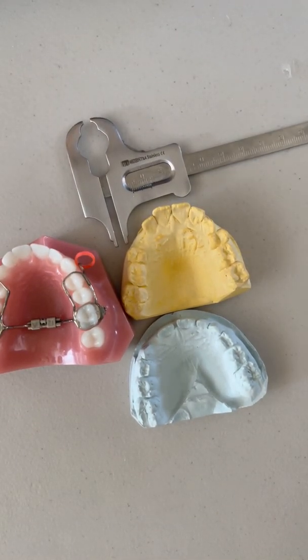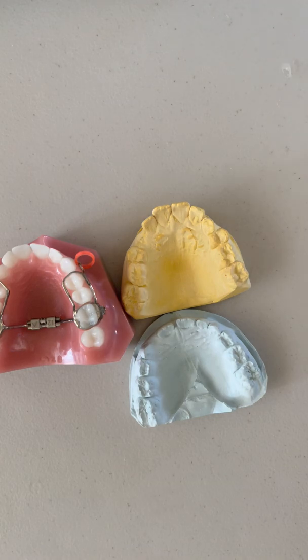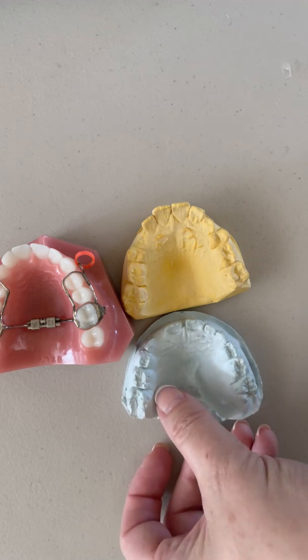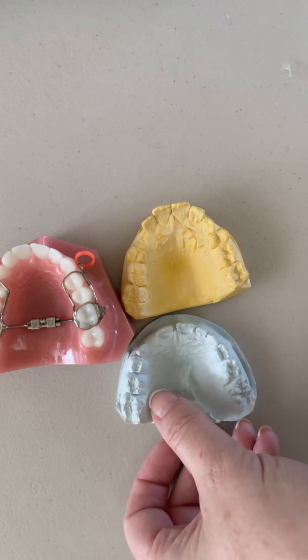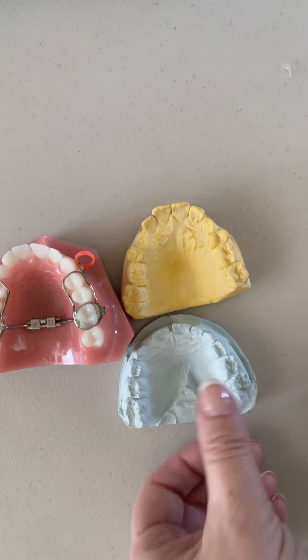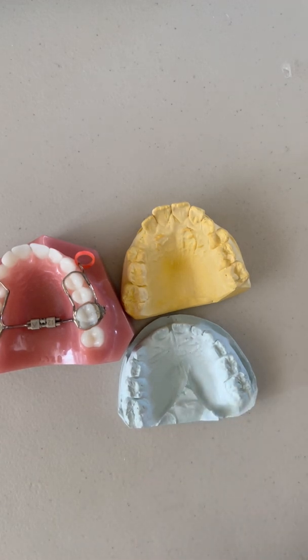Specifically, if you want to know if somebody needs an expander or has a constrictive maxilla, I'll take you through my thoughts on how to use a Boley gauge to measure transverse width. This is loosely based on what McNamara teaches — he's a super pro-expansion orthodontist who teaches using the cemento-enamel junction of the sixes, which are teeth 3 and 14. But finding the CEJ on kids with puffy gums can be tricky, so I've modified it to use the mesial palatal cusp tips. Different morphologies, anatomies, tooth sizes, and rotations mean this is just a screening tool to mesh with your other screening tools.